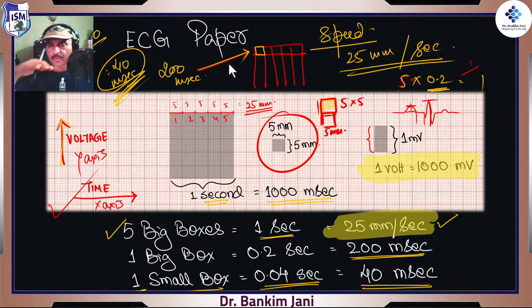If it is a small spike, it's a low voltage. If there is a flat curve going on, it means no activity is happening. And that's why, in movies, when something happens in the climax, they show that line going flat, and then there is some dialogue, and then that person comes back suddenly, and it starts with those ECG waves.